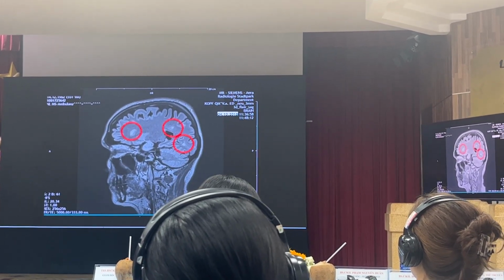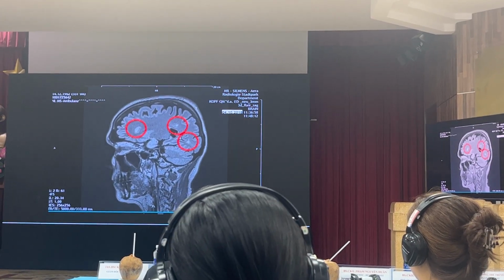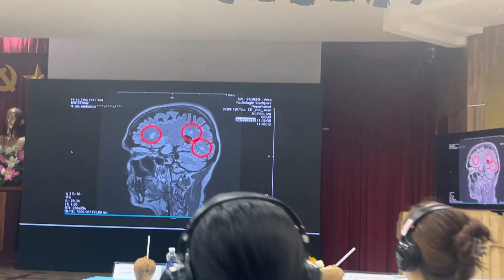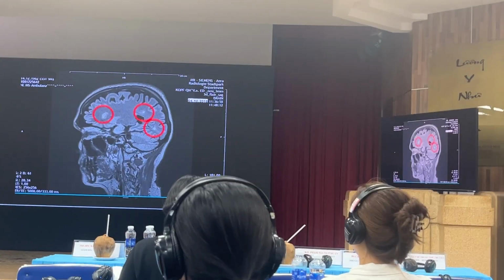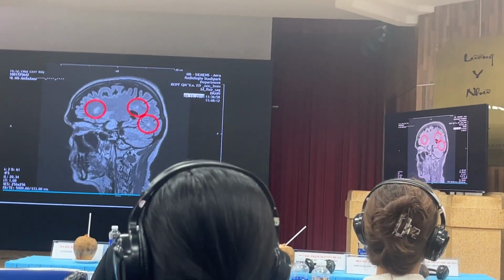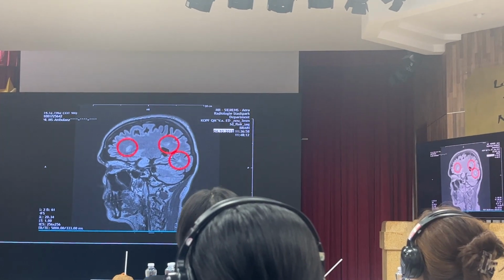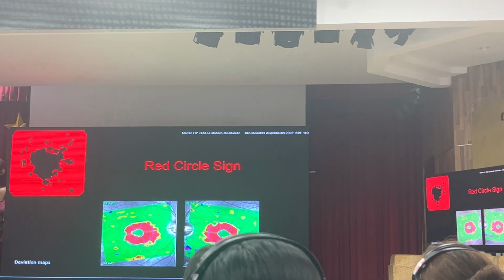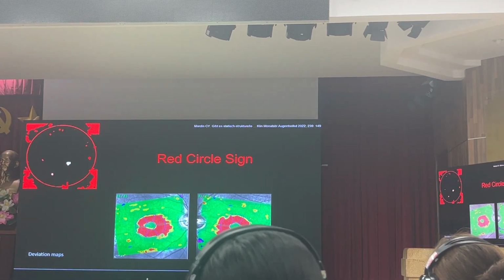And that's the reason why the neurologists in our place start to do OCT examinations themselves. So they don't ask us, they do OCT examinations, even OCTA examinations. In Munich and Berlin, there are two centers for neurologists at the university who do very good research work on that. And they are using OCT as we use it as ophthalmologists. That's quite interesting. So the red circle sign is a very sensitive and important sign.